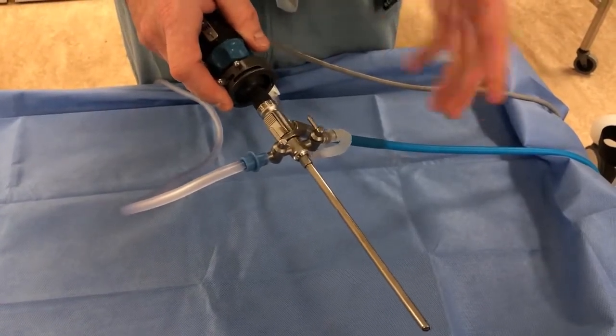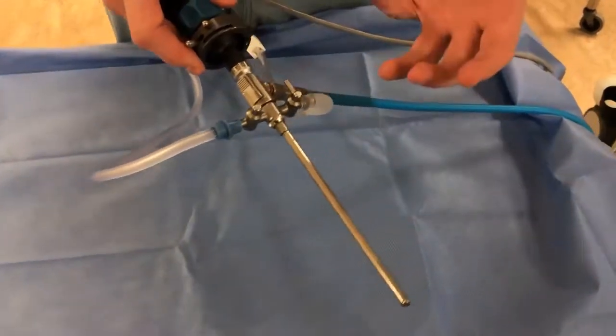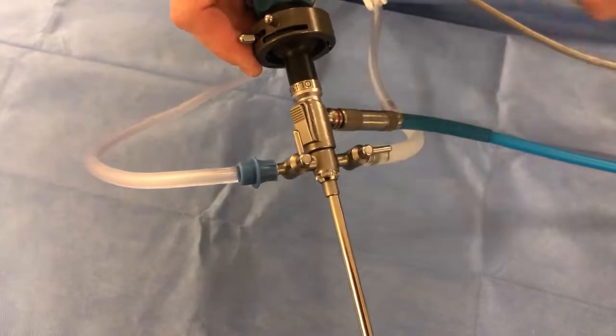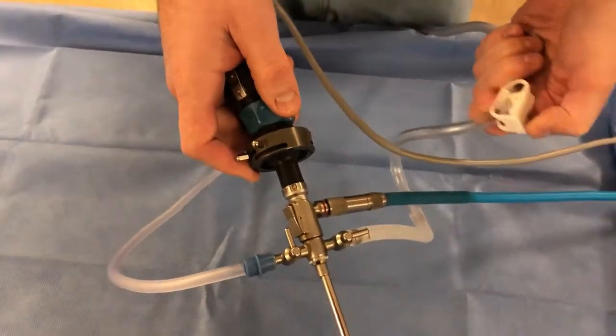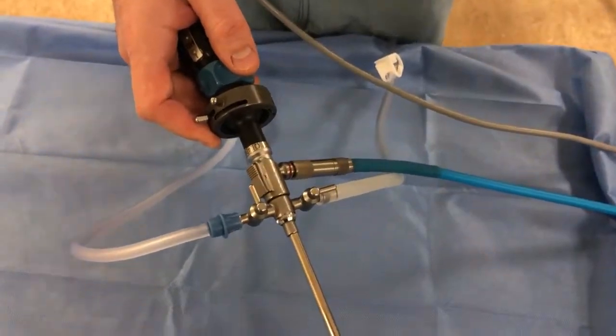A common mistake is forgetting to turn the inflow on — people get excited about doing arthroscopy and forget. Make sure you turn that stopcock and check that the tubing is completely unclamped, so you have good distention and visualization.